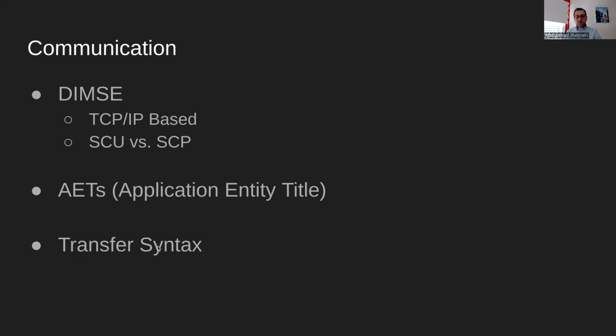And then of course, transfer syntax is the next thing that happens, which is basically to say, here is what I'm about to send you. Tell me if this is something you can actually work with. And again, if you're using the analogy of email, if I know that you only speak English, I'd rather be sending you emails in English, because if I sent you emails in Arabic, you probably wouldn't understand that very well.